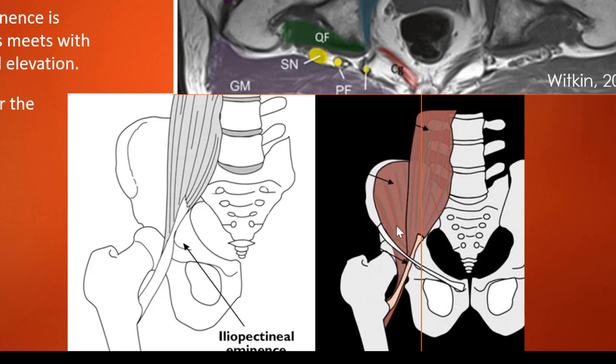The iliacus tendon, which comes from over here in this iliac fossa, is obviously more lateral, and it fuses progressively into the psoas tendon. The most medial fibres of the iliacus fuse with the iliopsoas tendon, whereas the lateral fibres out here are not really part of this complex. So the lateral fibres go directly onto the lesser trochanter. And sometimes they can be seen to overlie the anterior hip in our standard anterior hip view.